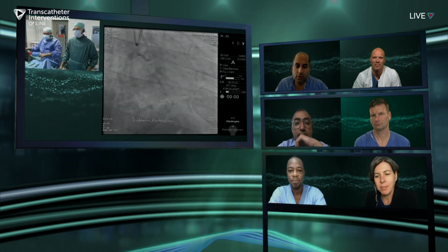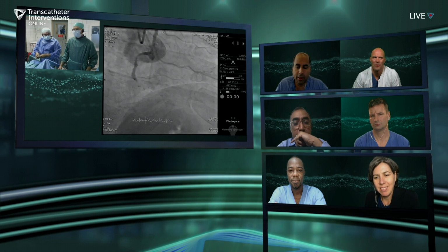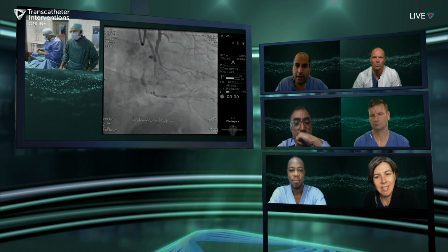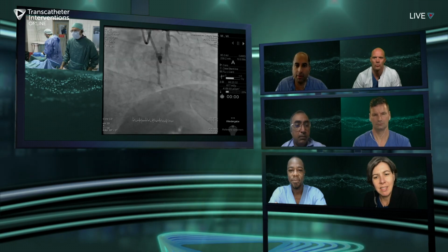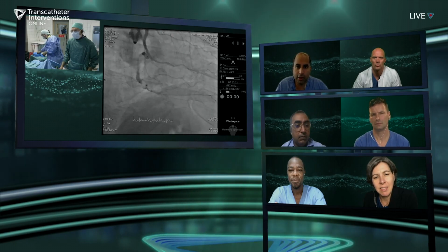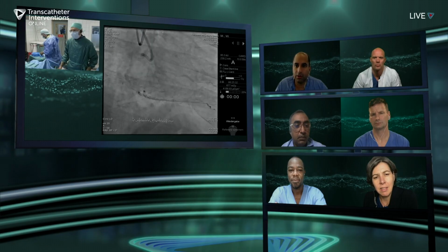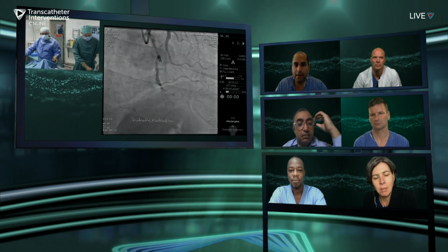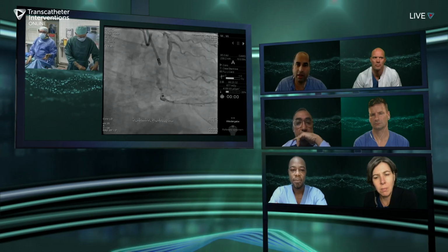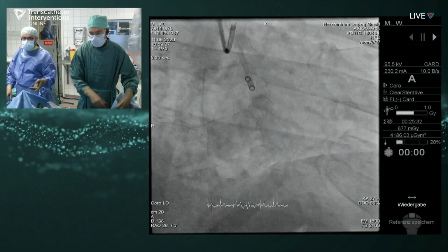They're telling us we're actually running out of time on this. Look, you've gone through methodically, you know, how you do this: antegrade, then parallel wire, now going retrograde. I think you're going to get the right setup. There are abundant septals. It may not be the first one that you find, but you'll get it, and then you'll be able to deal with that bifurcation in a much more controlled way by going retrograde.